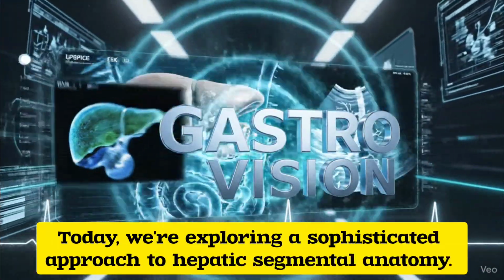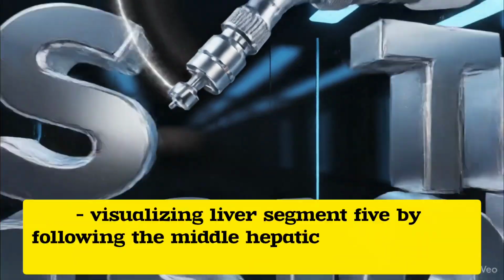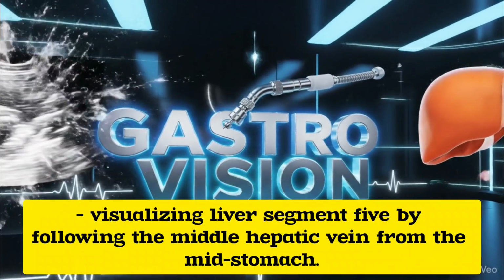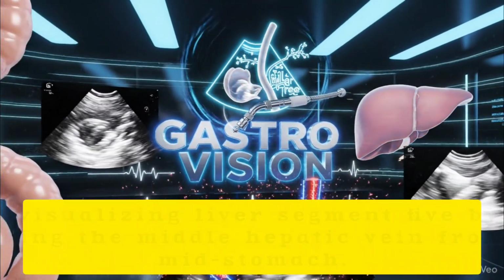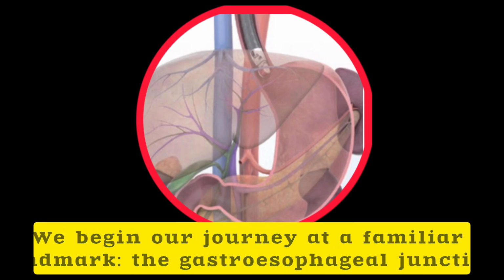Today, we're exploring a sophisticated approach to hepatic segmental anatomy, visualizing liver segment 5 by following the middle hepatic vein from the mid-stomach. We begin our journey at a familiar landmark, the gastroesophageal junction.